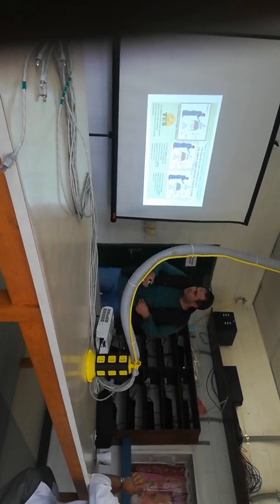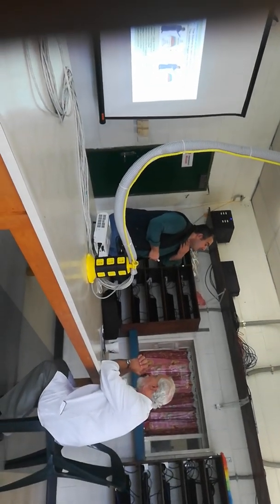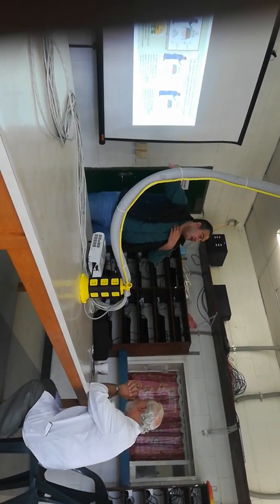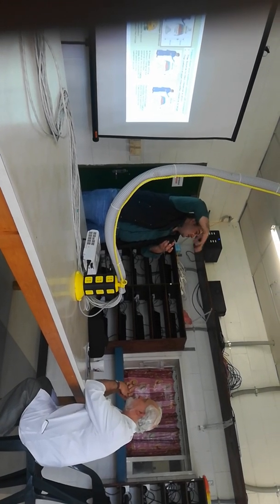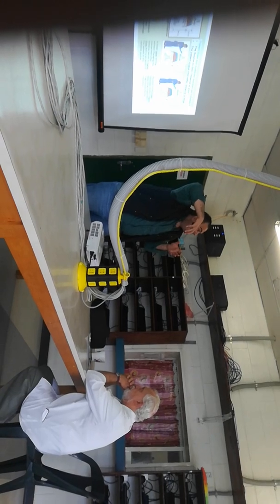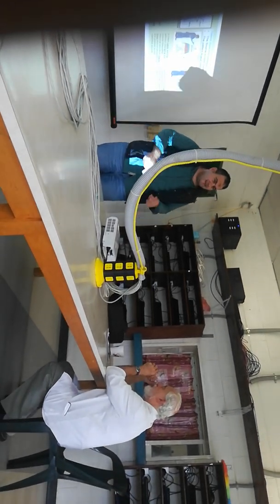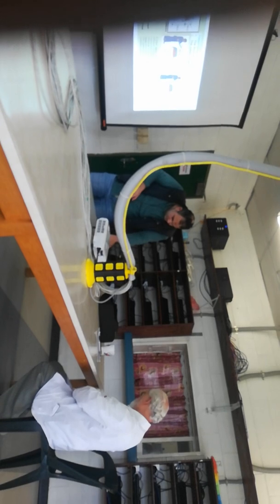So that means put the X-ray tube closer to the patient? No. The X-ray tube should be as far as possible from the patient. But the image intensifier, the receptor, the detector, should be as close as you can.